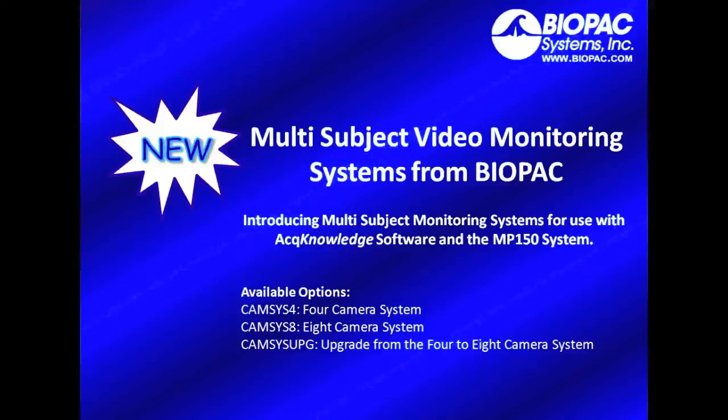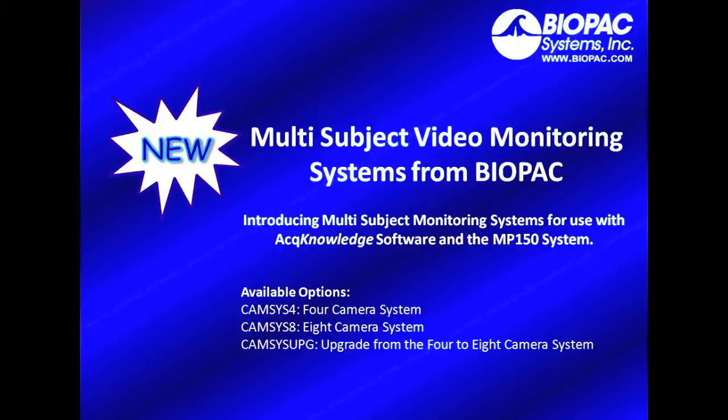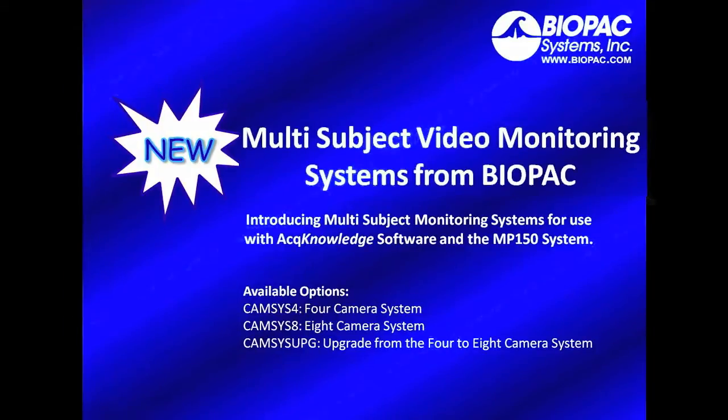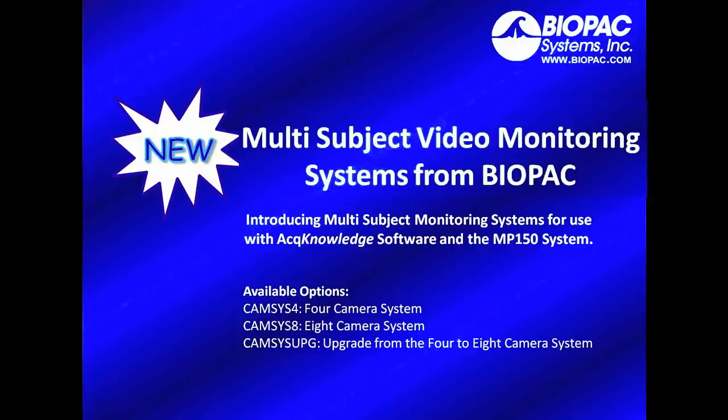New from Biopac Systems. Biopac is proud to introduce multi-subject monitoring systems for use with Acknowledge software and the MP150 research system. Available options include a 4 or 8 camera system, as well as an upgrade from the 4 to the 8 camera configuration.